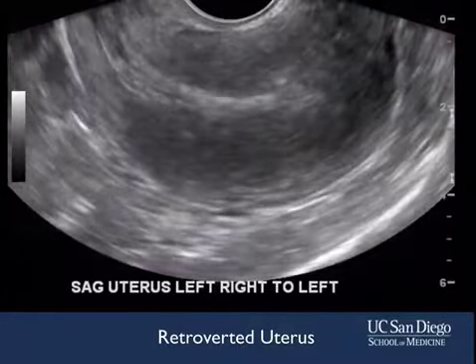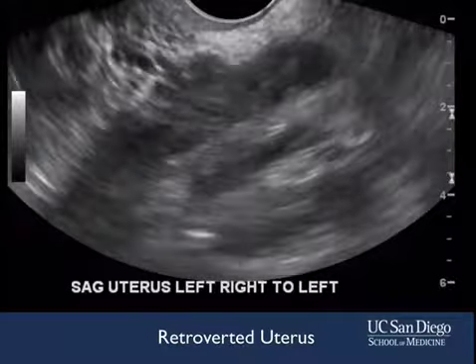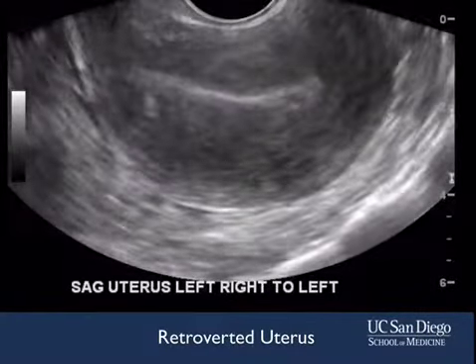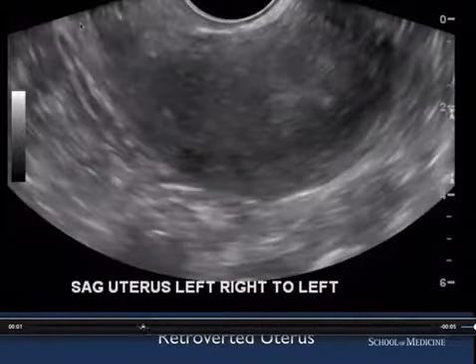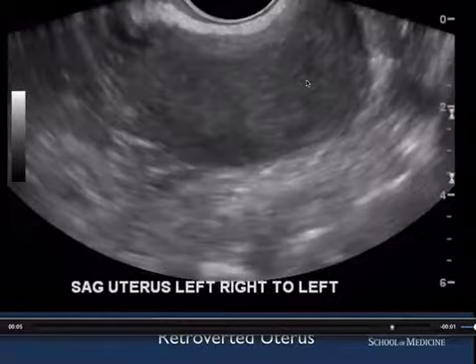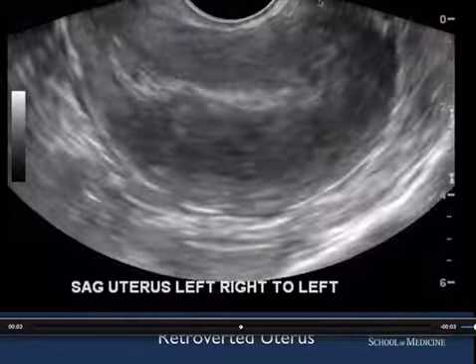And this is an example of what we will see in a retroverted uterus, which may represent 15% of women. Here, we will see that the cervix is actually anterior to the fundus. We can follow the endometrial stripe posterior to find the fundus of the uterus.